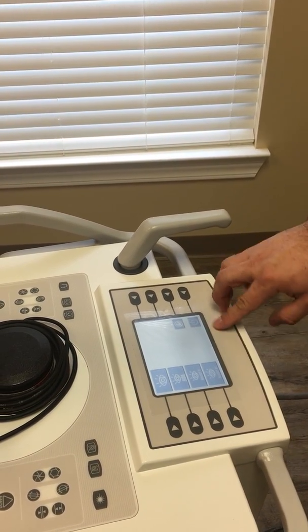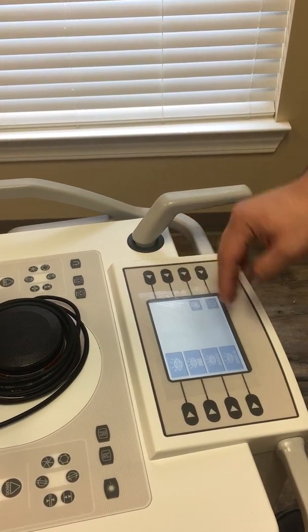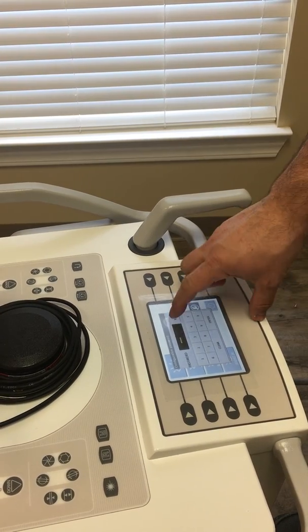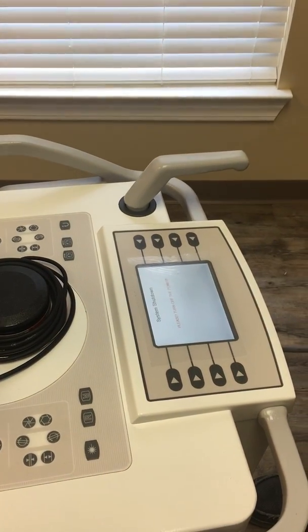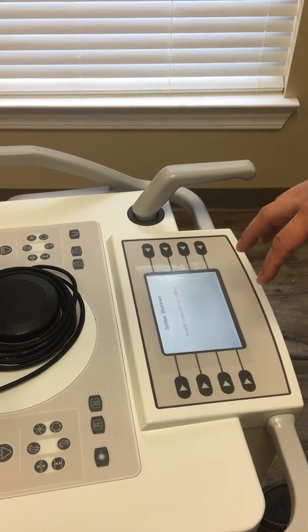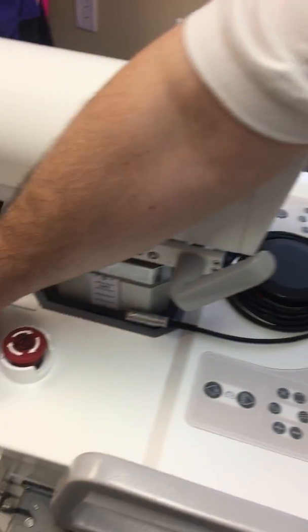Okay. All right. Then over here, these two buttons really aren't all that functionally useful. This would get me into a service mode. It doesn't do anything for you. This button, if you hit it, turns off the operating system on the C-arm, but the C-arm's still powered up, and then you can't do anything. So then you have to turn it off, turn it back on.